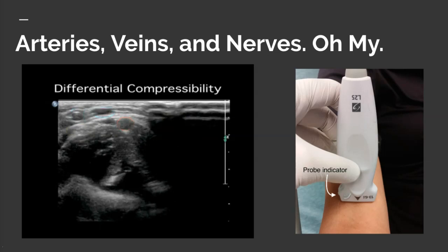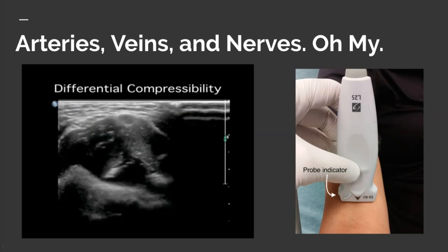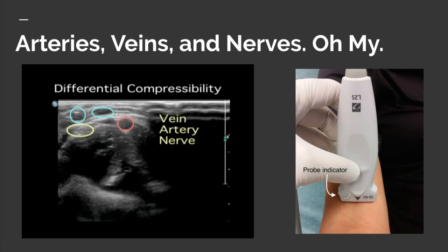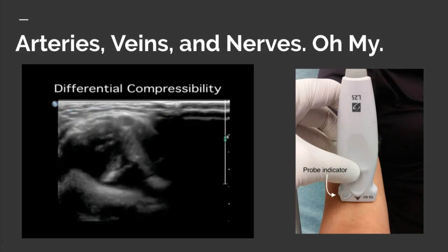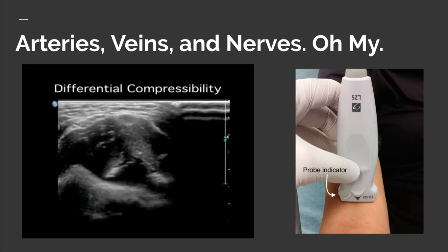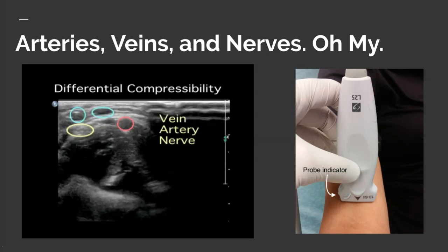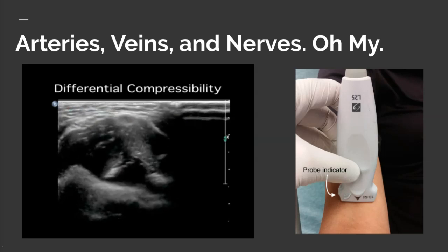Nerves are also non-compressible and non-pulsatile. You can see on the screen here — the circle in yellow is a nerve, the blue circles are veins, and the red is an artery.